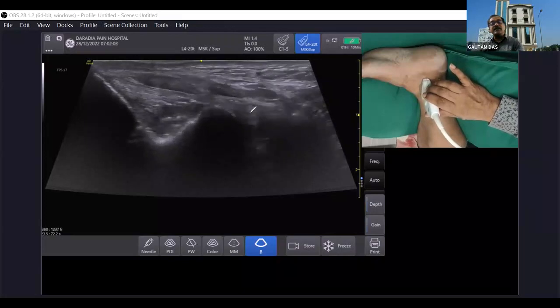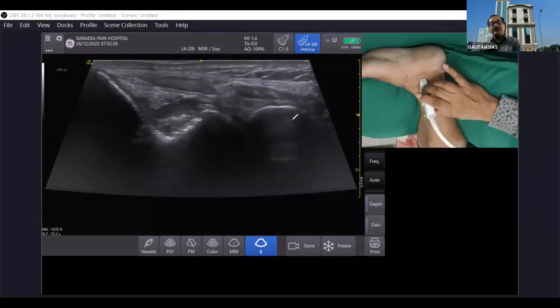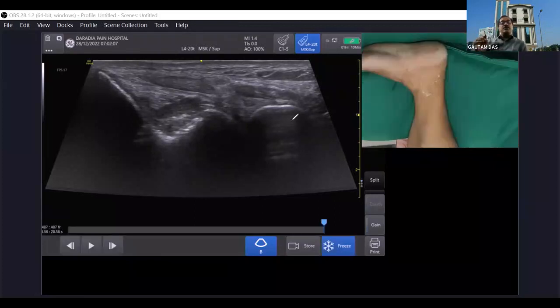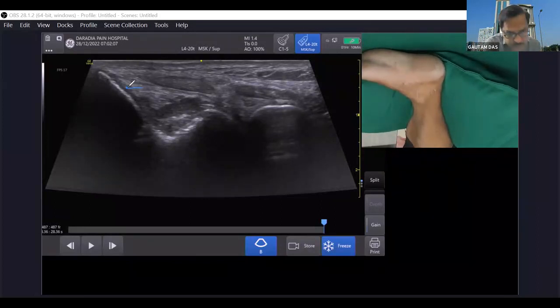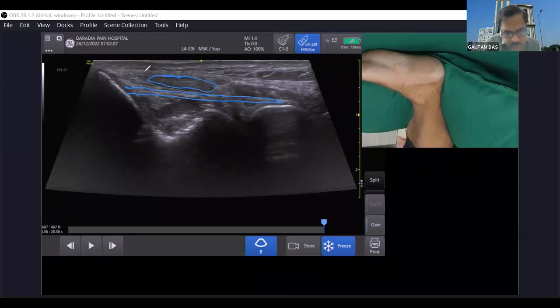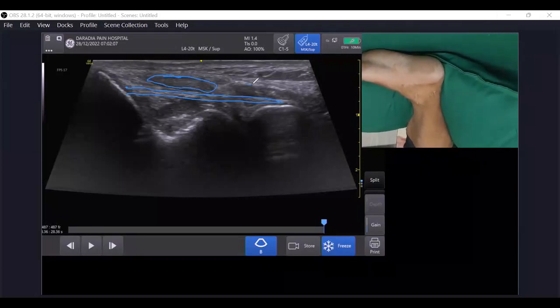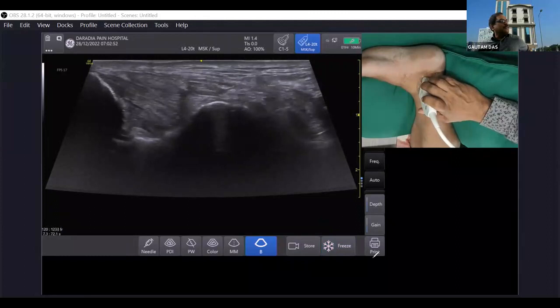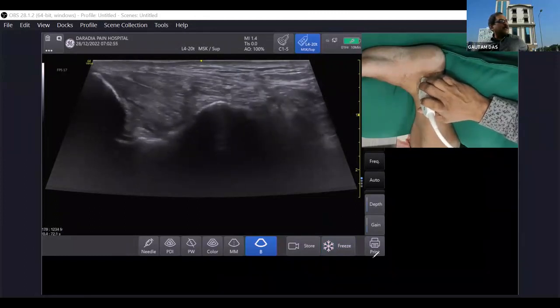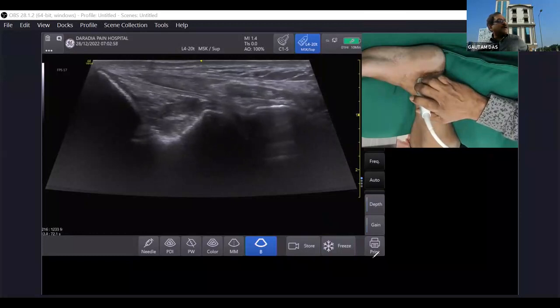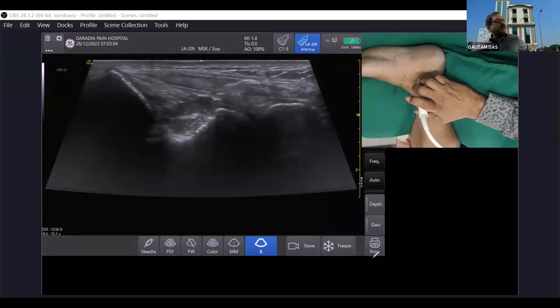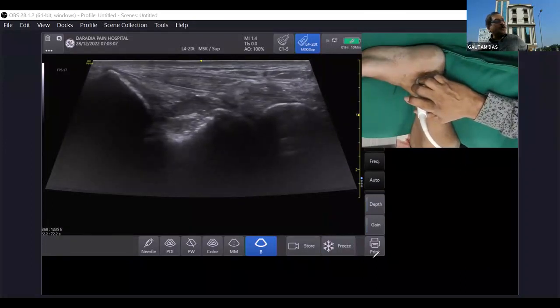The tibio-calcaneal ligament is now very nicely seen — going from the tibia and medial malleolus to the sustentaculum tali. Two tendons are also visible in oblique view at this position.